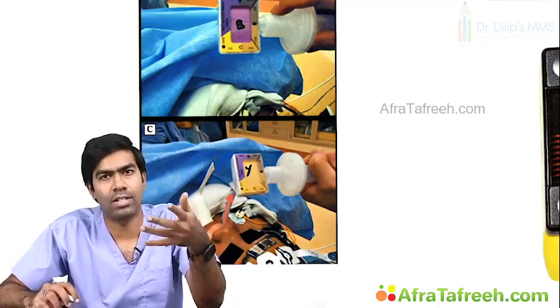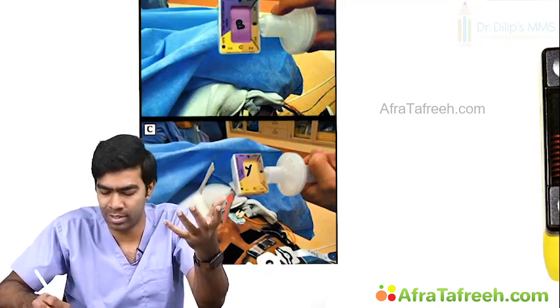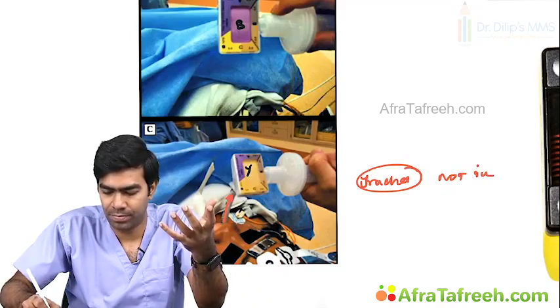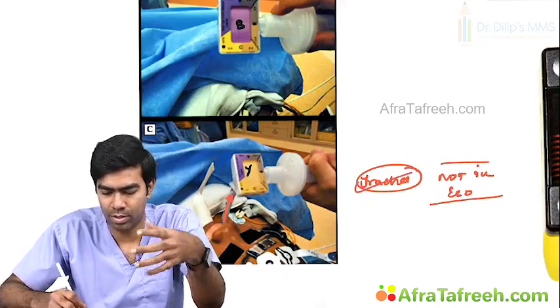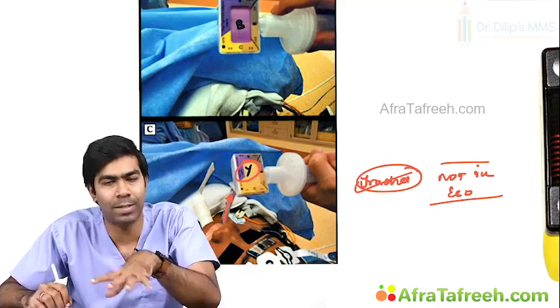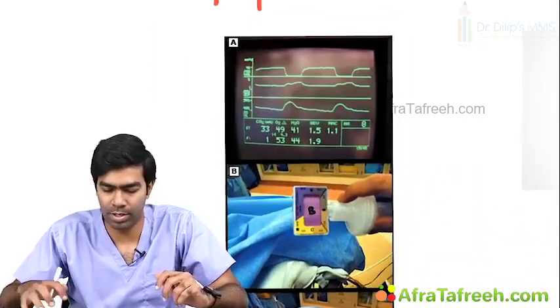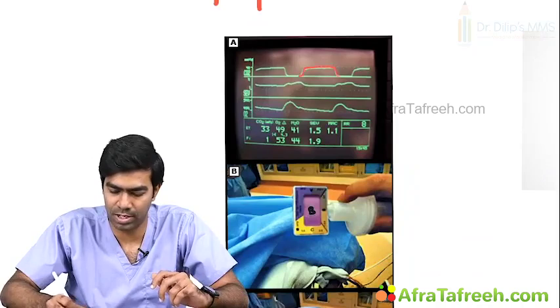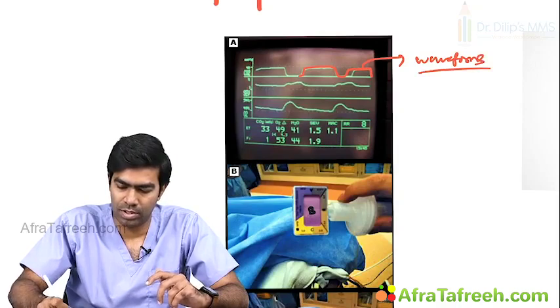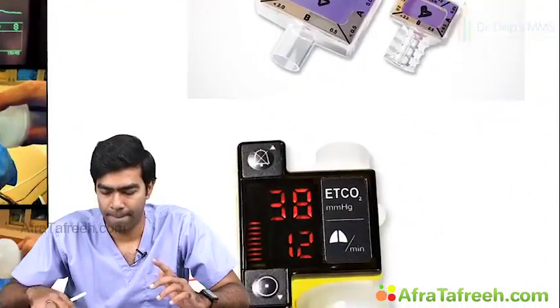This capnography and this colorimetric detection of carbon dioxide is the gold standard to tell that the endotracheal tube is in the trachea and not in the esophagus. So if you see this, definitely I can tell the endotracheal tube is in the trachea only. It's not in the esophagus. Okay, this is the colorimetric method, and in the same patient you can also see nice little waveforms of carbon dioxide. This is the capnogram. Clear? So this is one method.